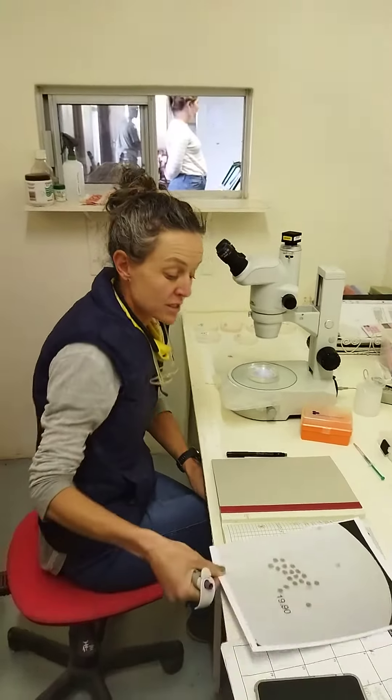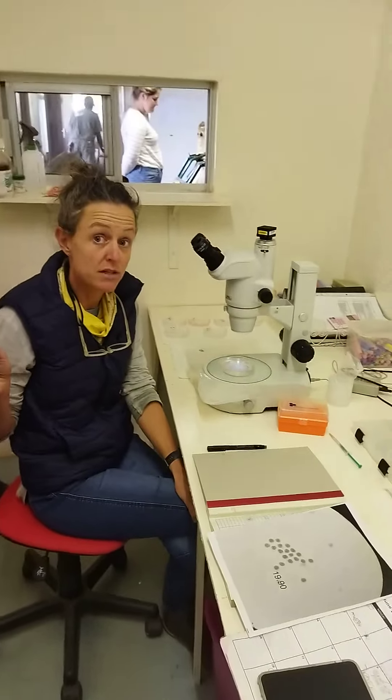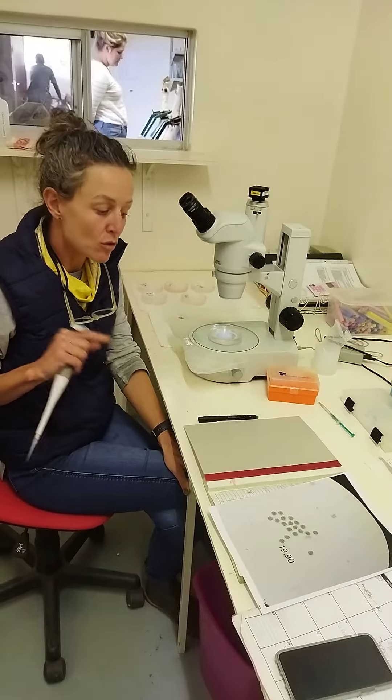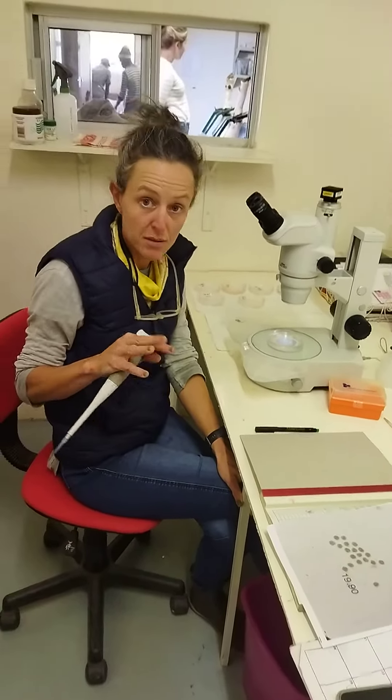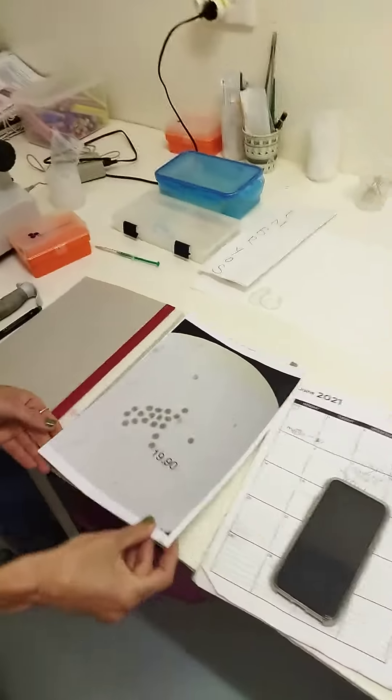If you freeze them, the process is different. Once they're frozen, they can stay frozen for years — 20, 30 years if you like. The thawing process is a bit more tricky; you've got special media that you need to thaw them in, but it's very easy to transfer.